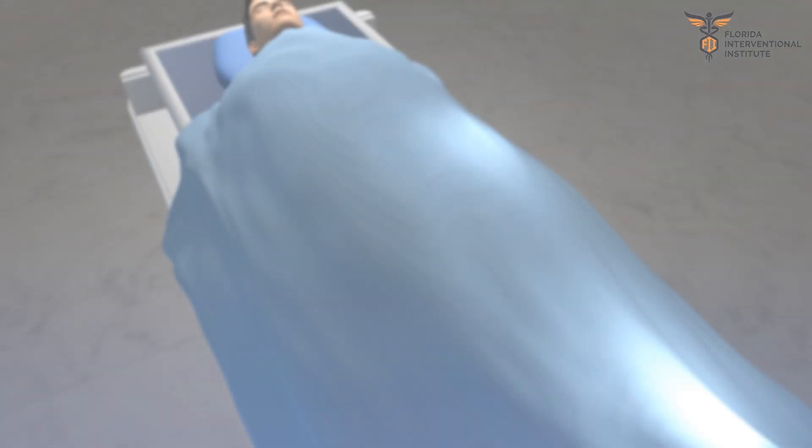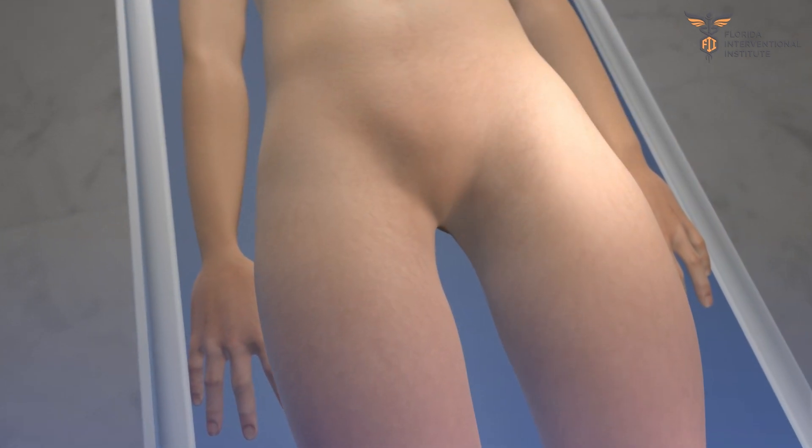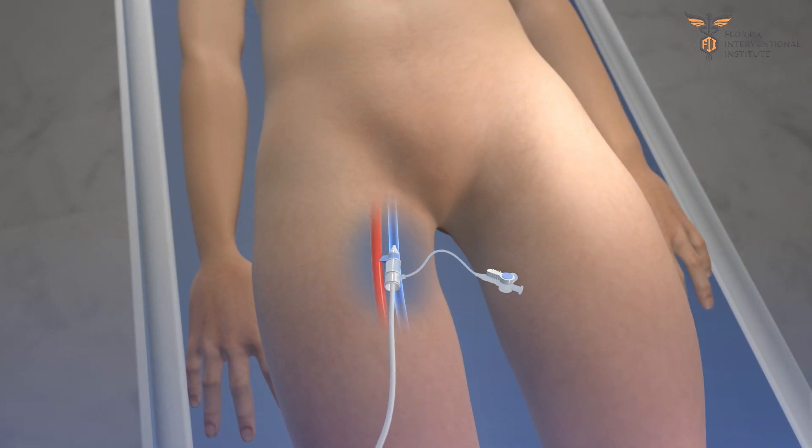During a varicocele embolization procedure, a catheter, or tiny plastic tube, is introduced into the vein in your neck or groin through a tiny skin puncture.